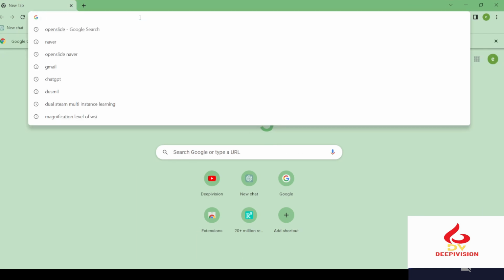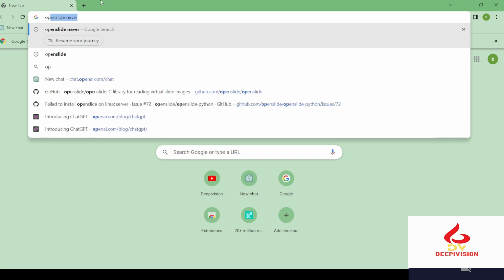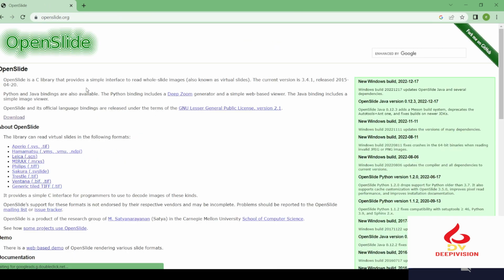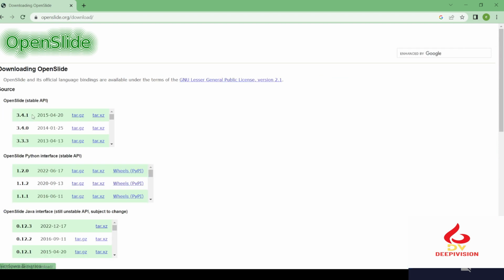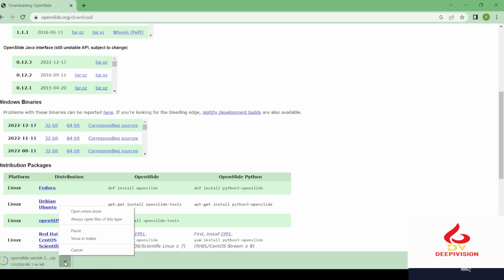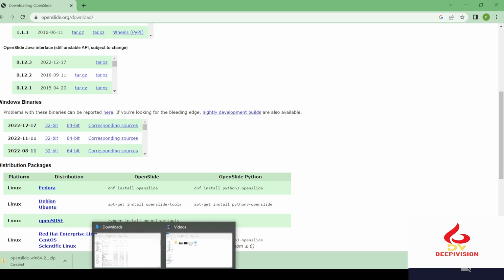So first of all, we need to open the OpenSlide page that I already gave in the link. Okay, first one, and you need to download from here the Windows binaries. Any of these you can choose. In my case, I will choose the first one. Like this. I already downloaded it, so no need to download again.